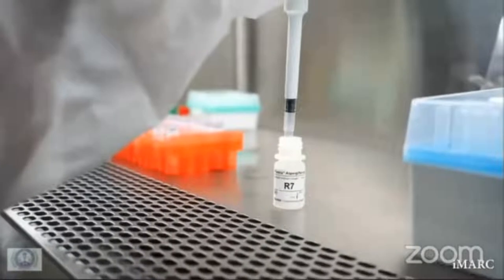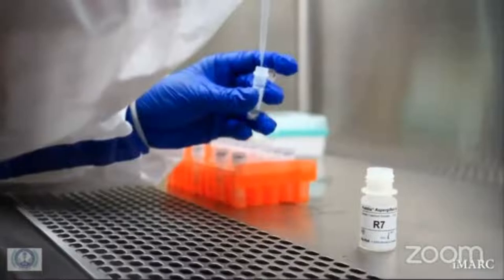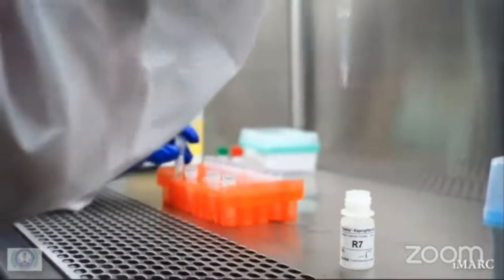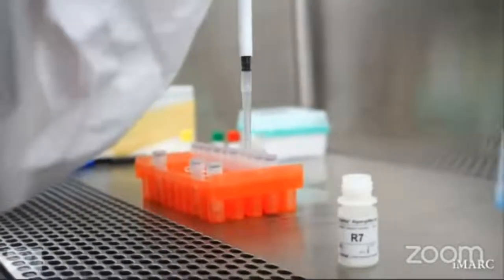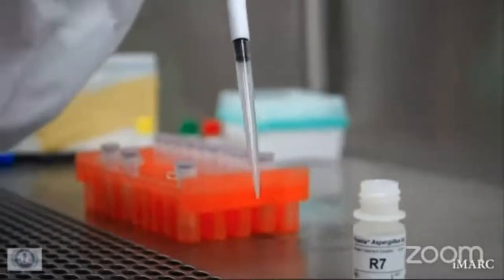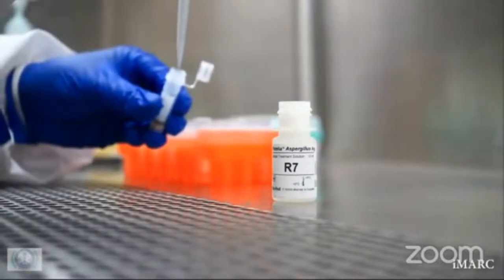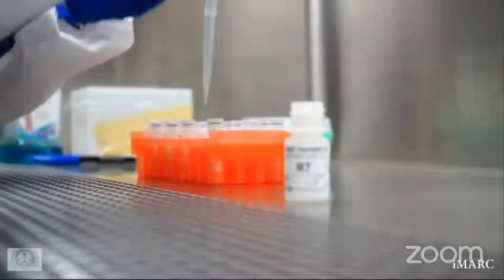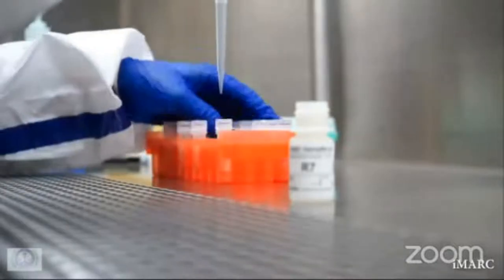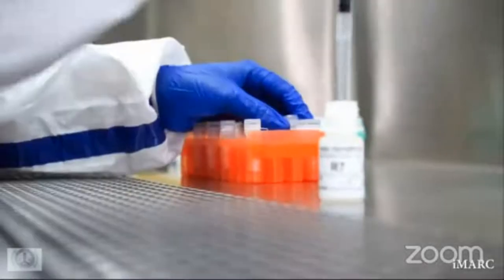We will add 100 microliters of sample pretreatment solution to the controls as well as the test samples of BAL and serum. After the addition of R7 sample pretreatment solution, we will vortex each sample tube along with the quality control tubes. Make sure that all the tubes are tightly closed to prevent opening during the heating step.